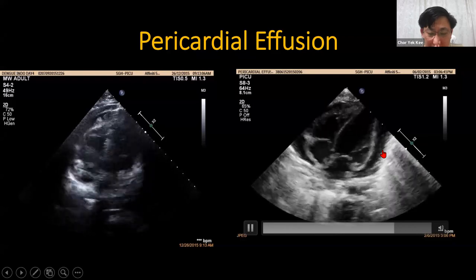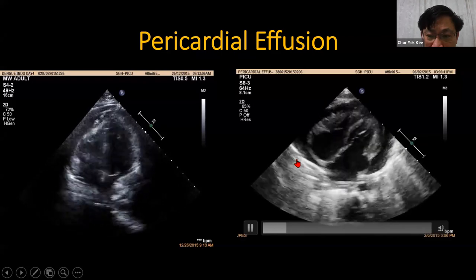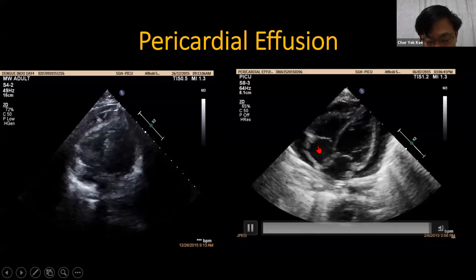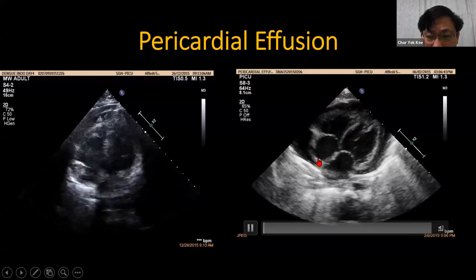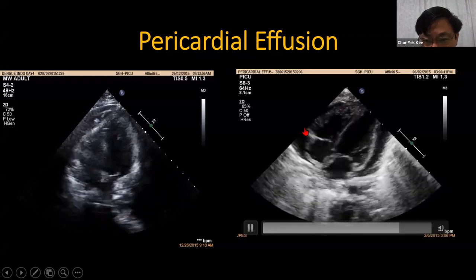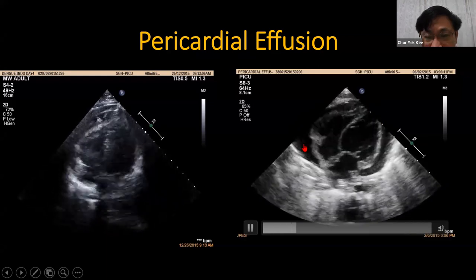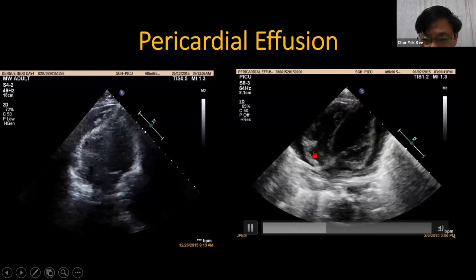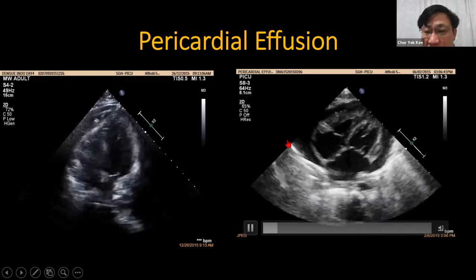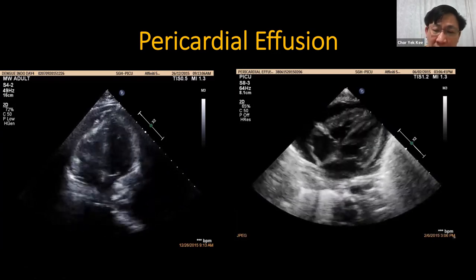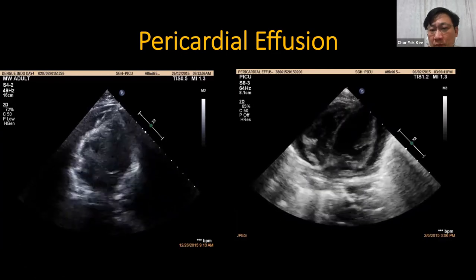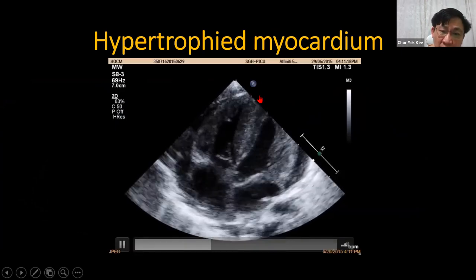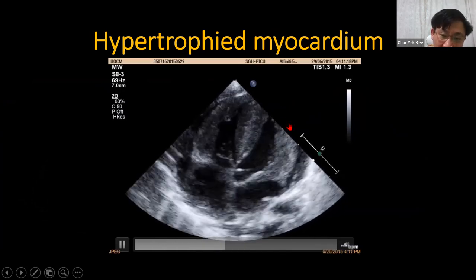To determine if pericardial effusion is causing significant problems, we look at the atrial size. The normal CVP is five to eight millimeters of mercury. If the pericardial effusion pressure exceeds five to eight, it will compress the atrium. When the atrium is being compressed, it means pericardial pressure is more than five to eight — this is significant and the effusion needs to be drained.